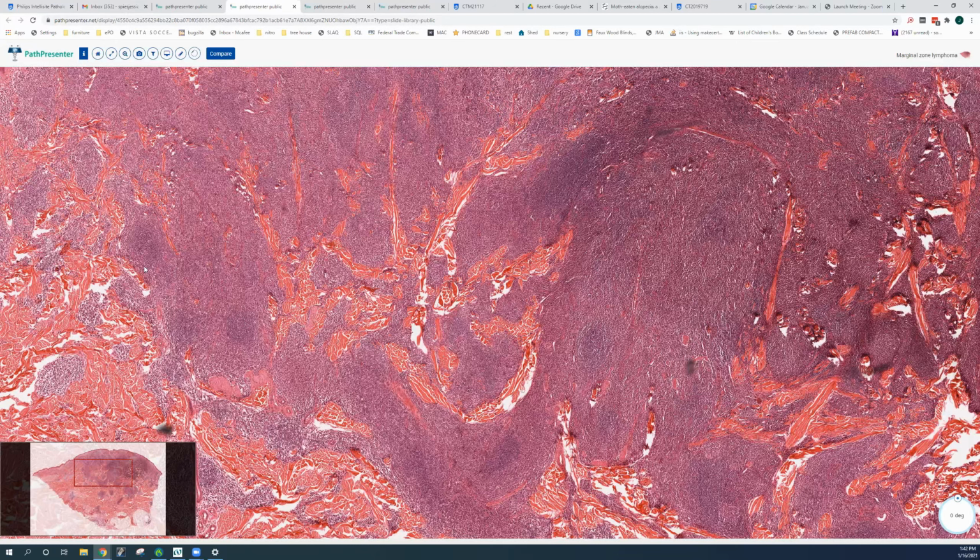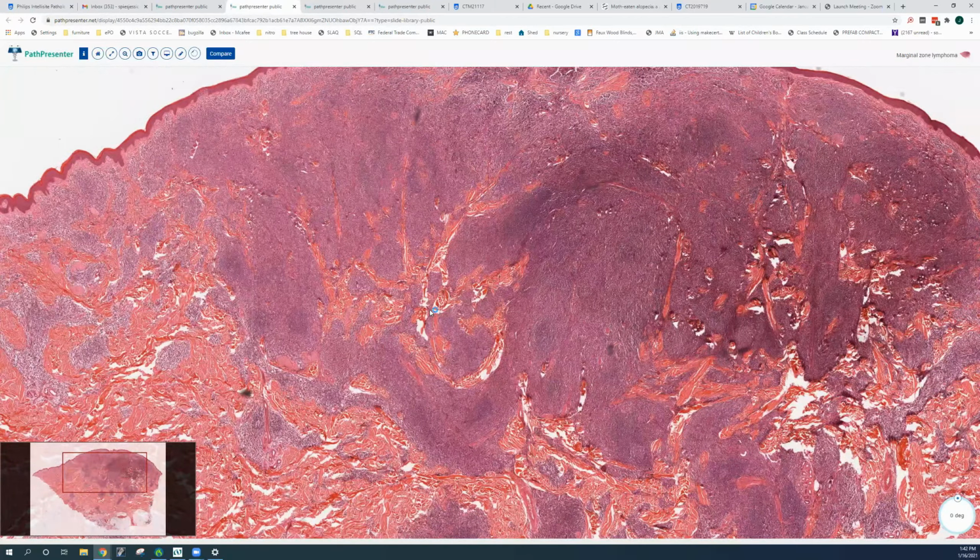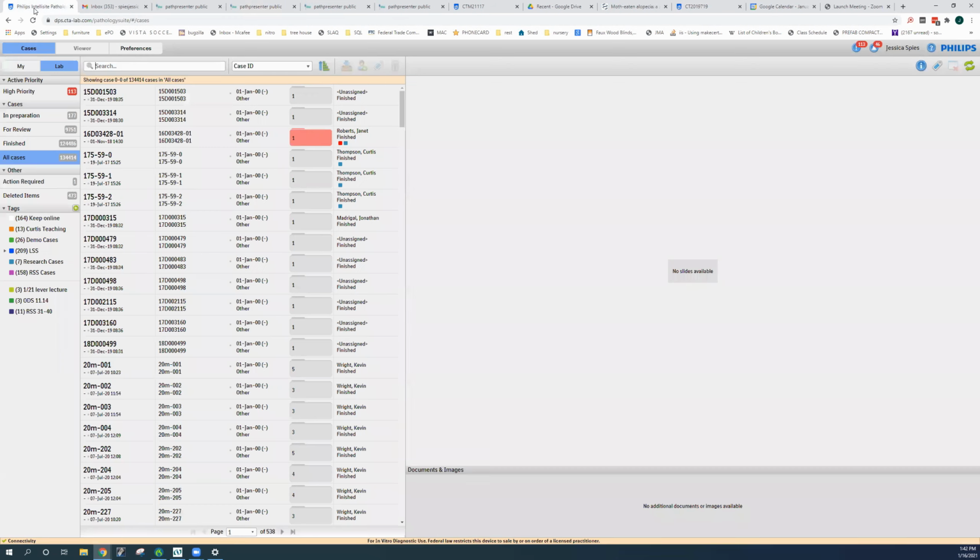Because there were no immunos to go with this particular case, I did want to show you a recent case of cutaneous marginal zone lymphoma we had in our practice. This was not Borrelia associated to my knowledge, but I want to show you the light chain restriction.